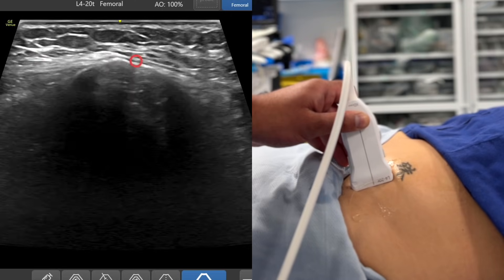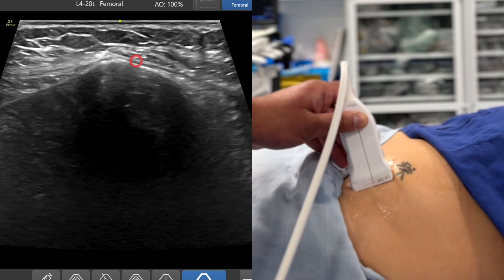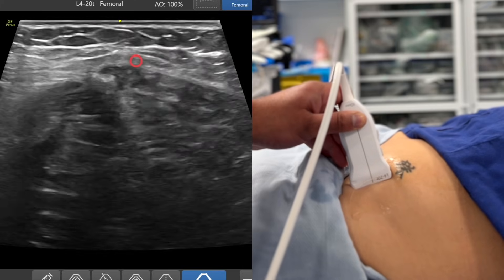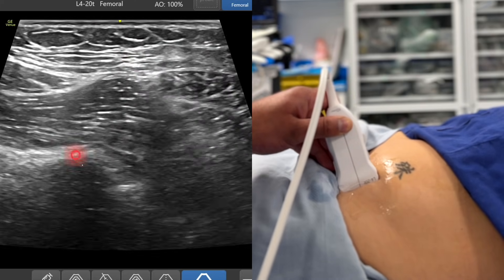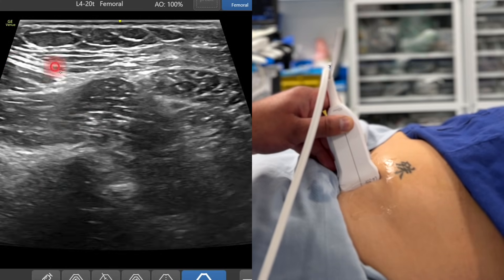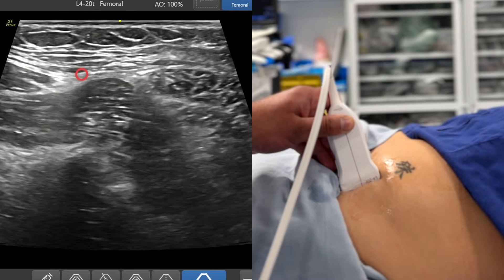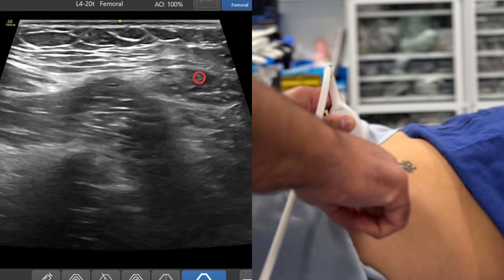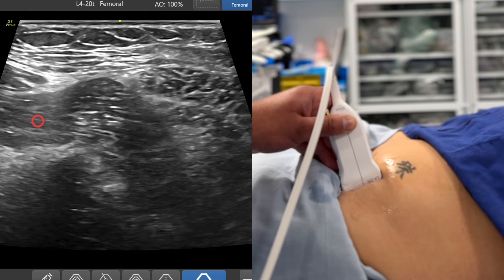Having identified the anterior superior iliac spine, to scan for a suprainguinal fascia iliaca block, I'm just going to slide the probe medial — so from lateral, slide it medial. As soon as I do that, you'll notice you get something on the screen: you get bone down here, which is the anterior inferior iliac spine. Infralateral down here on the left hand side of the screen is sartorius. Supramedial up here on the right hand side of the screen is the internal oblique, and this is iliopsoas.